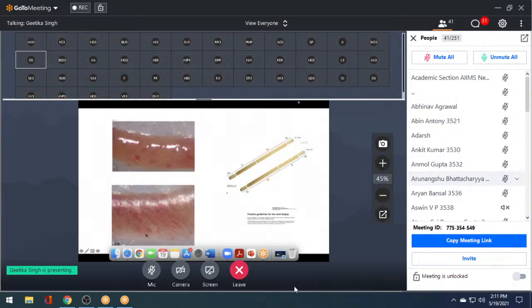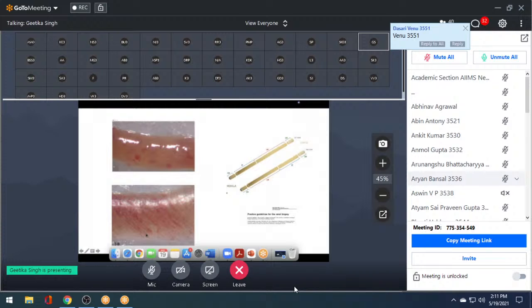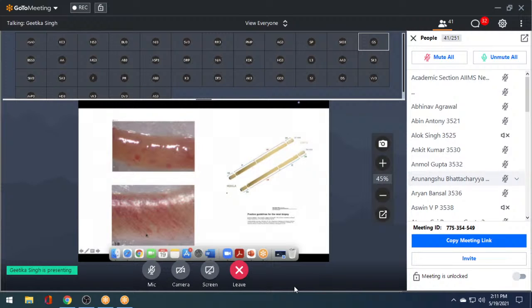Sometimes when the nephrologist or radiologist, whoever is doing the biopsy, goes too deep into the kidney and you only get medulla, then it's a big problem for us because we don't have the tissue that we need. Now, if we have the representative tissue, it's not just processed as it is. Either the nephrologist will go in 3 times and give us 3 bits, or the pathologist will divide the tissue that is provided to them, because kidney evaluation does not stop at light microscopy. It needs immunofluorescence and it needs electron microscopy.